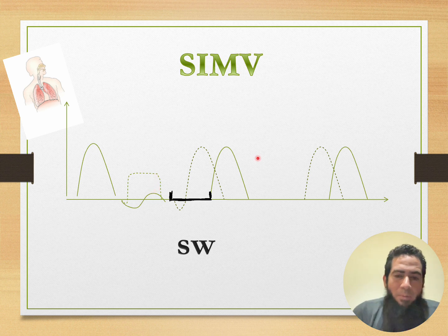But the main problem of SIMV is that sometimes it causes increased work of breathing, and there was a famous study done by John Marini, I think in 1998. I may be too old, but it concluded that SIMV is not the best mode to put your patient on. So SIMV is not that good, but it's important to understand it anyway.